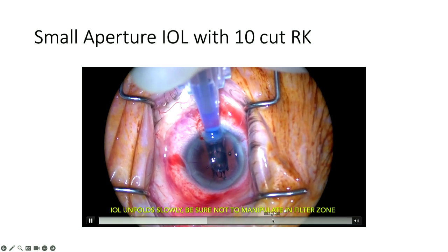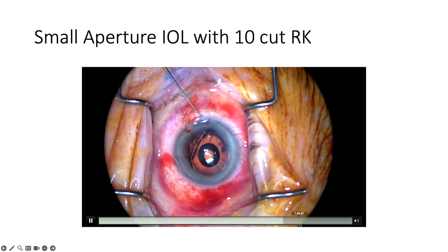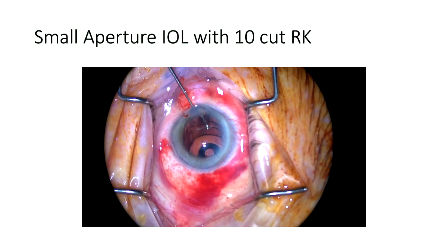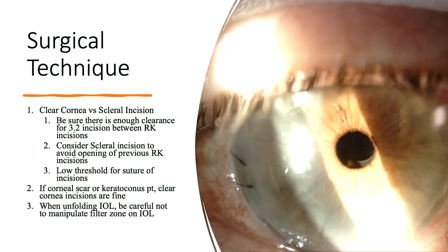It unfolds slowly, and the main thing is that after it's unfolded and you manipulate the lens, you need to avoid that filter zone. That is that dark area that gives the pinhole optics. So you actually need to be sure that you are avoiding the pinhole zone.